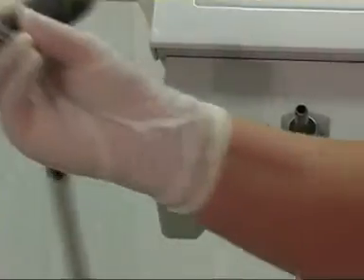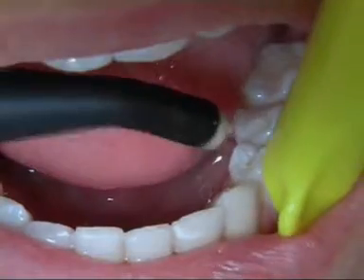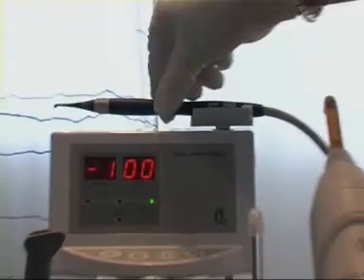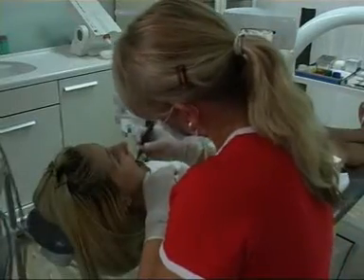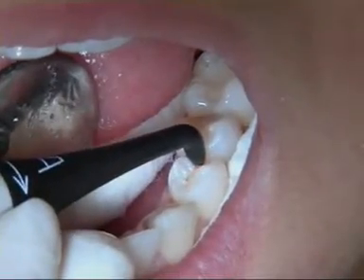A Kavo ProfiFlex air powder jet instrument is used to first clean the fissure and then to dry it. In order to guarantee that the fissure is completely free of germs, a laser fluorescence measurement is carried out using Kavo Diagnodent. Microbial activity must be below 10 or the fissure cannot be sealed.